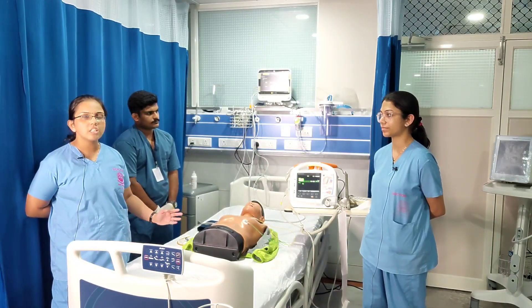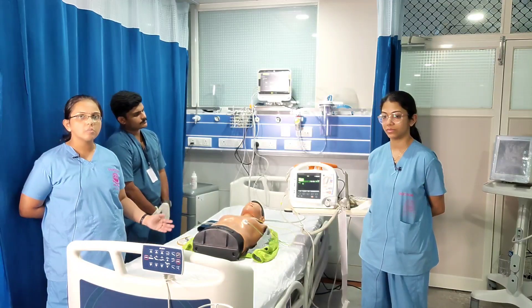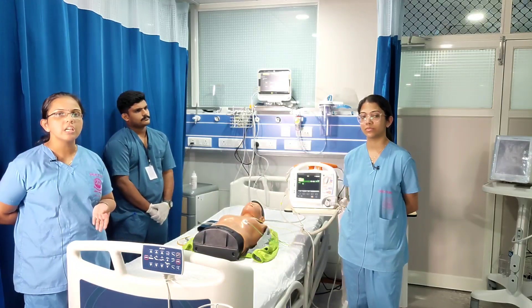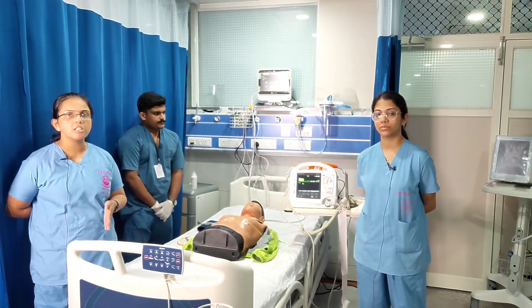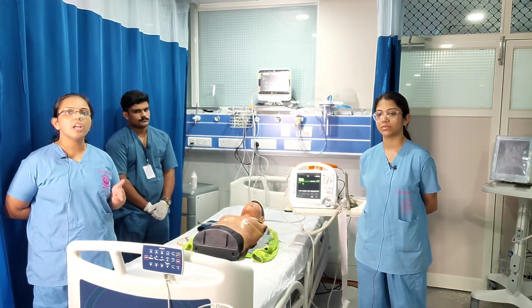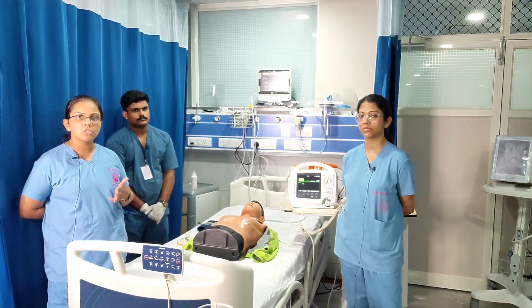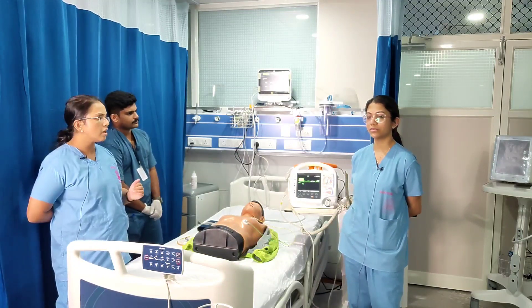So we will have to go for DC synchronized cardioversion. Since it is a wide complex tachycardia, we go with 100 joules. For DC cardioversion, we need to get consent, arrange the crash cart, adequately sedate the patient, and provide analgesia. After explaining the procedure to the patient, we can go ahead with the DC cardioversion.